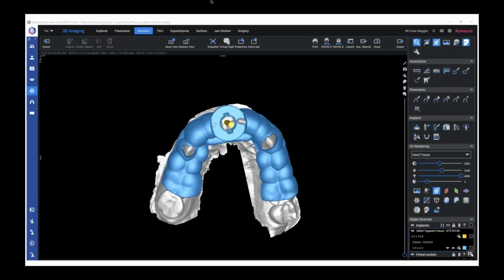However, I've found that I'm doing essentially all of my implant cases guided, even ones that I would consider to be easy freehand single unit sites. Think about an upper second premolar case with lots of bone, right? Easy to freehand. The reason that I'm doing it is, number one, I just feel more comfortable now knowing that the outcome is going to be perfect from an implant position, but also a restorative perspective. But number two, I found that it reduces chair time significantly.